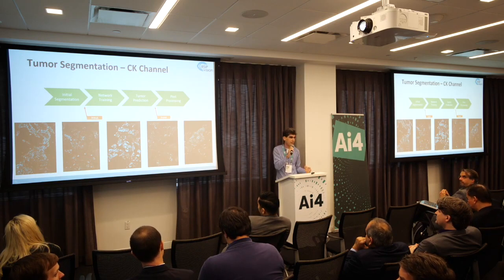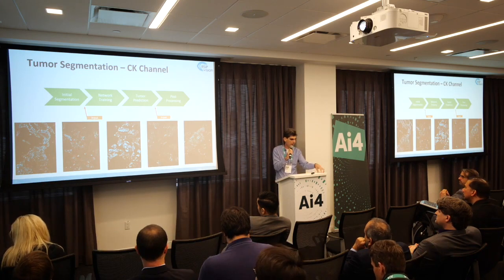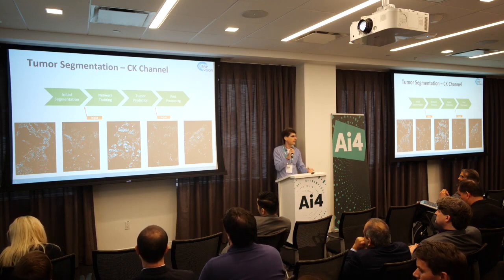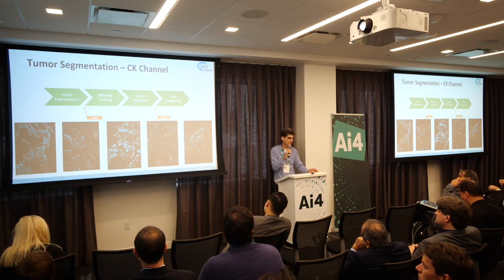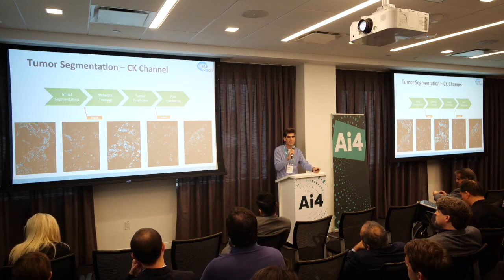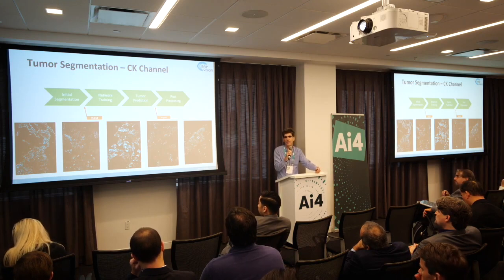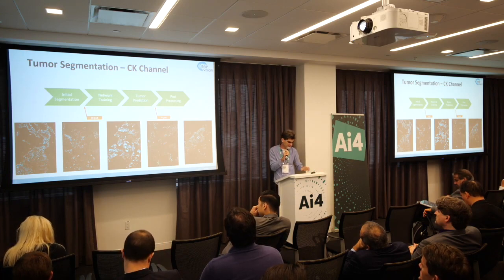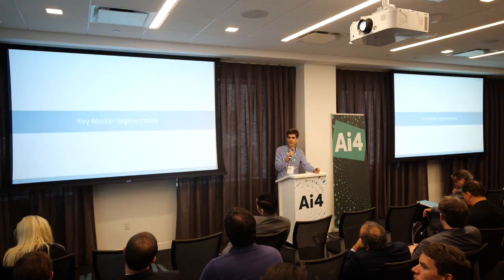And again, here, classical algorithms are actually your friend because you can hand tweak them locally to get a decent result. You can correct that. You don't even have to be too obsessive about correcting it perfectly in all areas, because what we find is that after you take even noisy training data and feed it into a neural network, the network is going to generalize better than the noisy training data. You can't just feed it in as is. You do need to correct it, but we found that we need to correct it less than we were expecting, and these networks are learning to generalize over the noise.